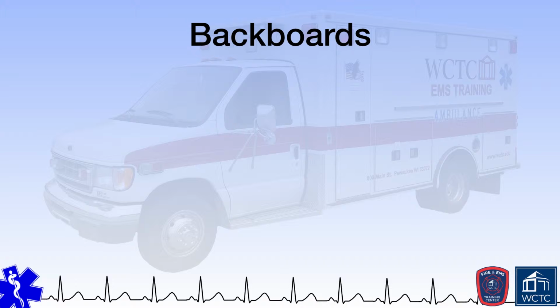While backboards were used historically for full spinal immobilization of patients with suspected C-spine injury based upon the mechanism of injury, emerging research and practice has begun to recognize that longboarding and fully immobilizing these patients may actually cause more harm than good. With that being said, backboards are still very useful for the movement of patients from the area in which they are found to a wheeled stretcher. Backboards come in essentially two types, long and short.